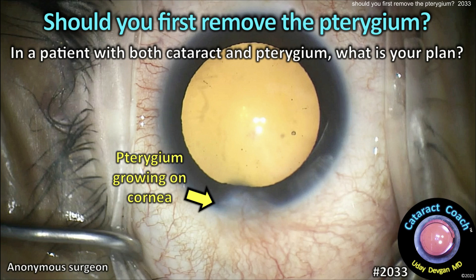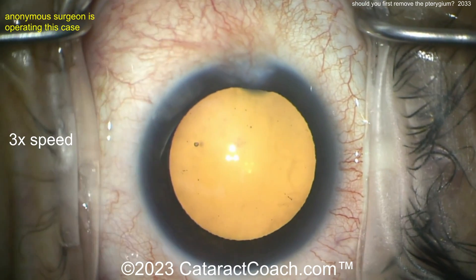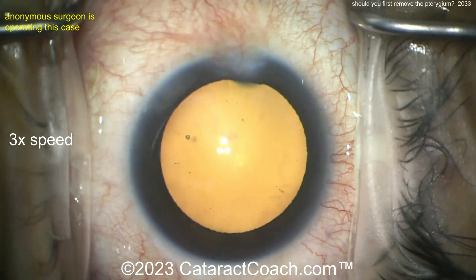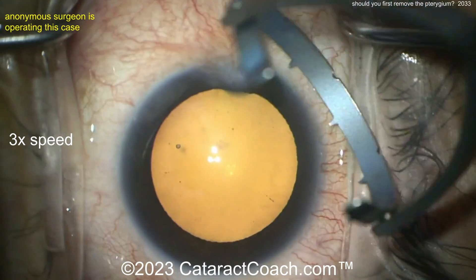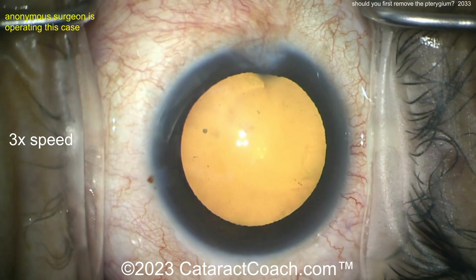cataractcoach.com — should you first remove the pterygium in a patient with both cataract and pterygium? What's your plan? Let's watch a case. This case is from an anonymous surgeon — just a routine cataract case, but you can see there's a significant pterygium extending probably at least two millimeters onto the cornea.